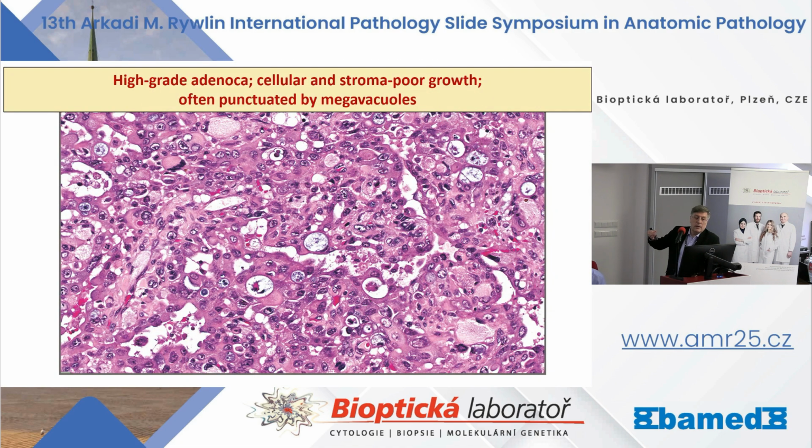So I'll show this group in the pancreas in a series of pictures. Please also imagine seeing these pictures from a liver biopsy or a peritoneal biopsy, because that's actually where, for pathologists, this is more helpful. The reason I say that is many of these pictures, if you showed me earlier on, I will say, yes, this could be PDAC, but it's probably not, because PDAC is usually not capable of doing it this way, but it does.